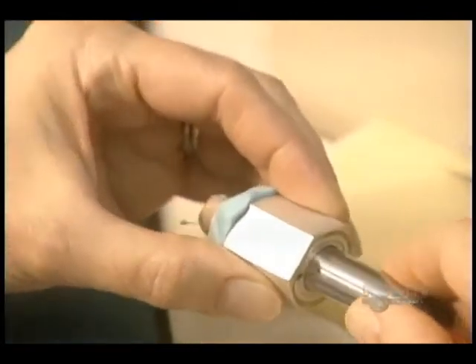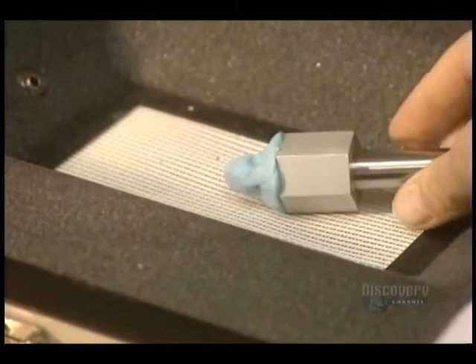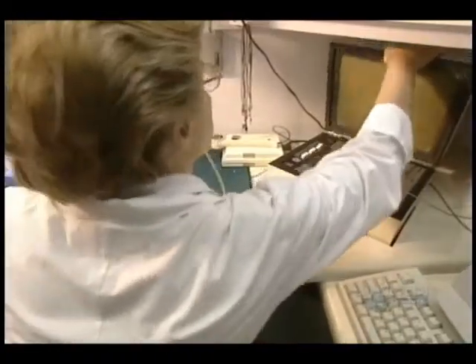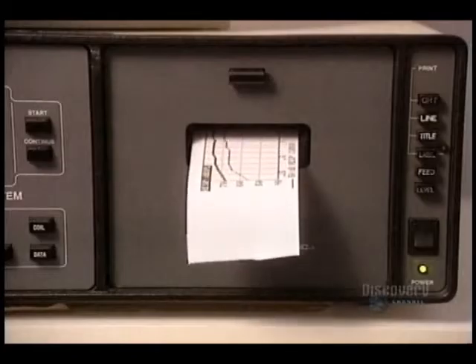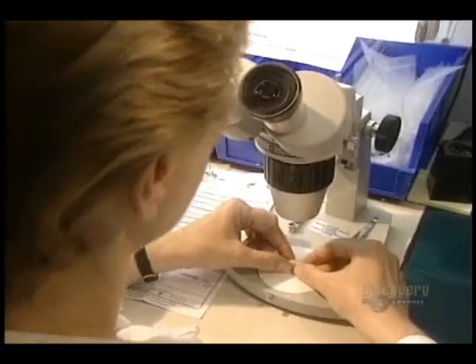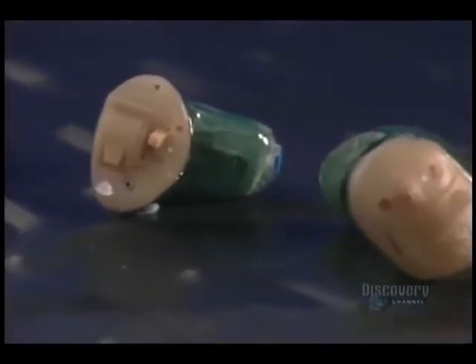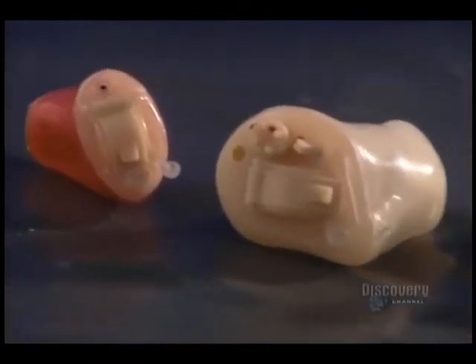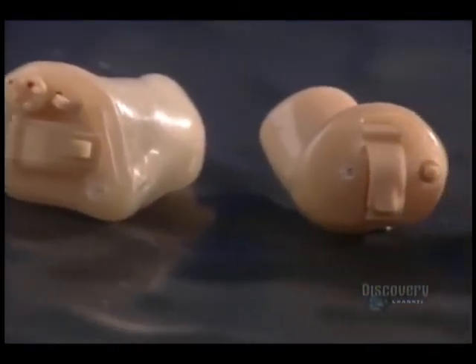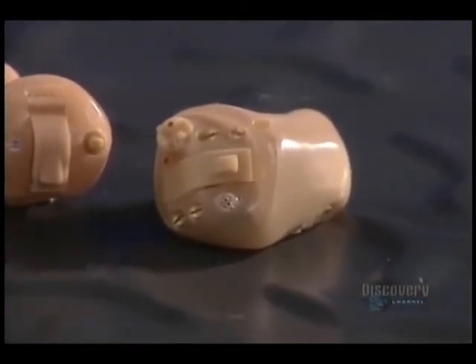The prosthesis is now completed. There remains one important step: verifying its electroacoustic characteristics. It's with this analyzer that they validate that the hearing aid conforms to the original prescription. These minute prostheses allow us to solve the main hearing problems. Microfabrication of a single unit requires a little more than two days of work.